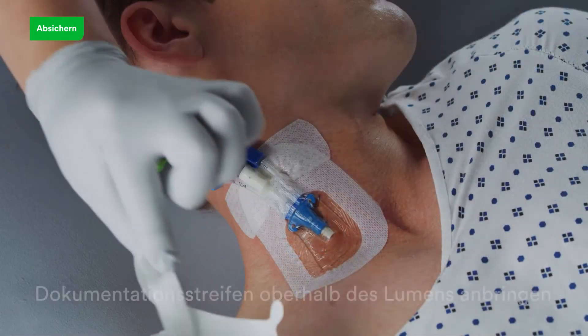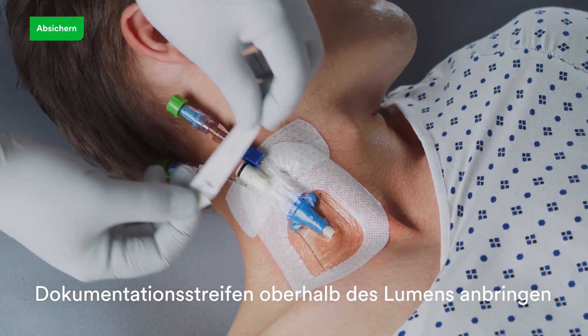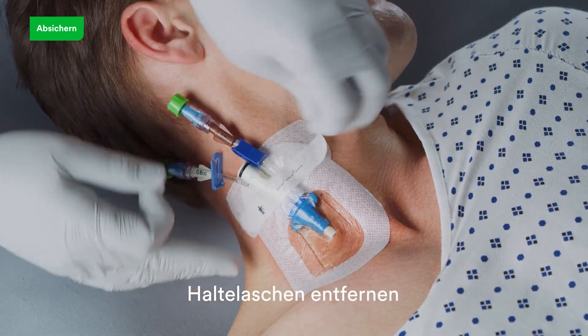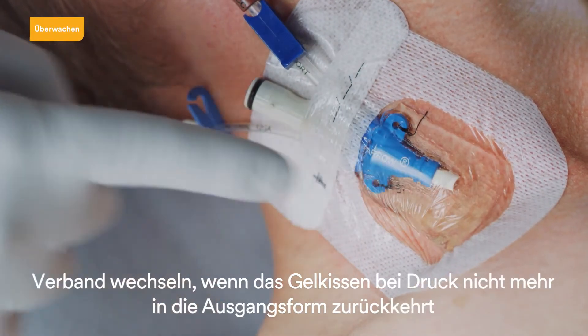Document the dressing change information on the documentation label. Apply the documentation label on top of the dressing over the catheter lumen or lumens. Remove the adhesive-free tabs.